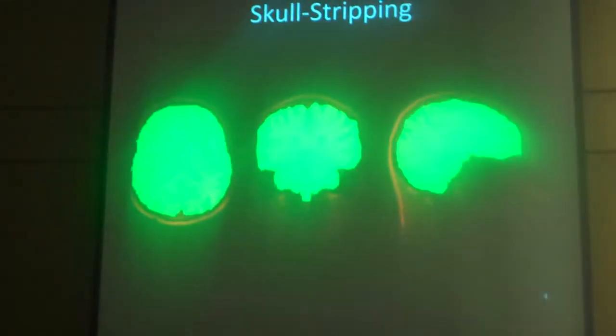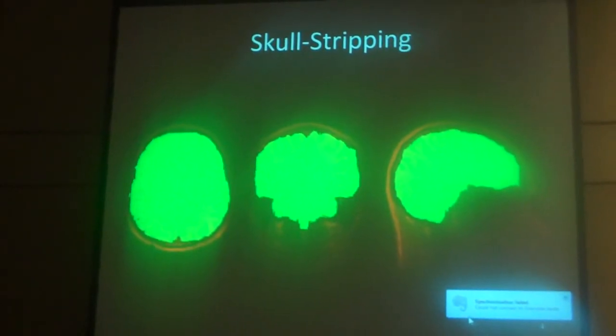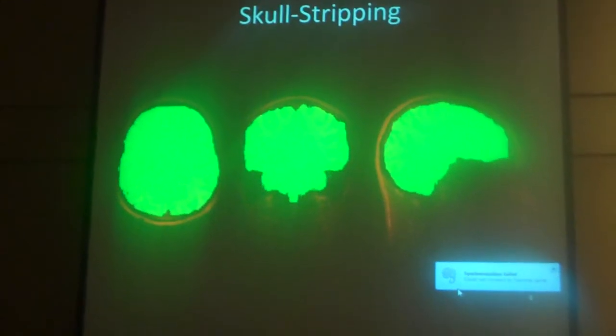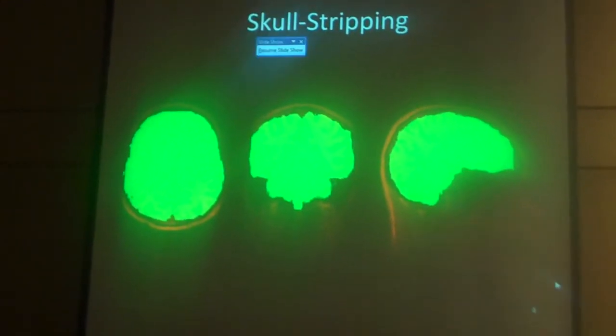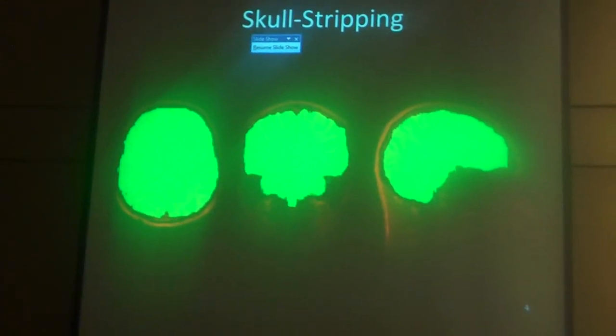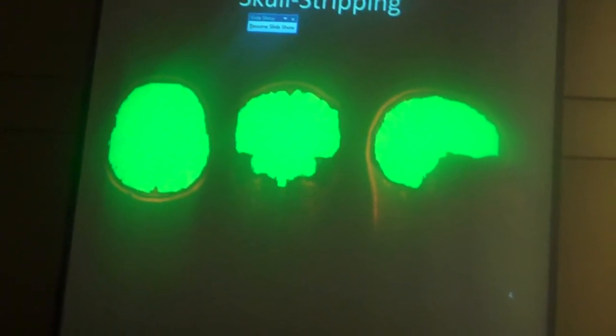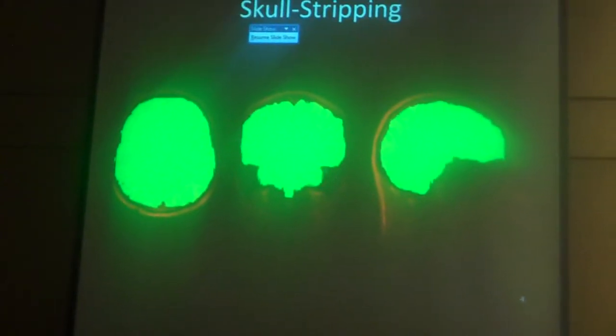It's used in registration, in longitudinal studies, in understanding how the brain is affected by disease, and extracting a cortical surface. Traditionally, it's done by experts who are trained in anatomy, who go in these volumetric images slice by slice and trace out the boundary of the brain. But this can be a time-consuming process and may not be consistent across tracers.